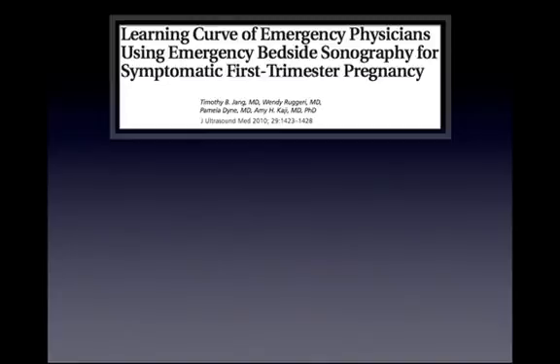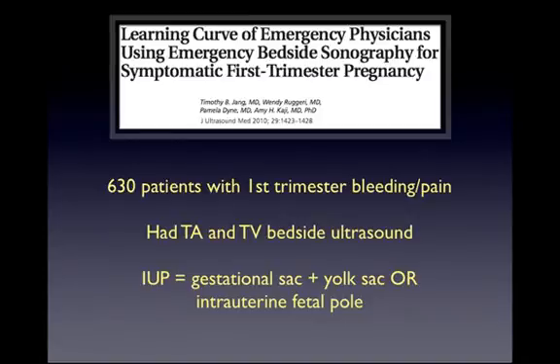But how easy is it to learn pelvic ultrasound? Jang et al. sought to assess the learning curve of emergency physicians using bedside ultrasound for symptomatic first trimester pregnancy. In this study, they looked at 630 patients with first trimester bleeding or pain who had a transabdominal and transvaginal bedside ultrasound. In this study, they defined an IUP as a gestational sac with a yolk sac or an intrauterine fetal pole.